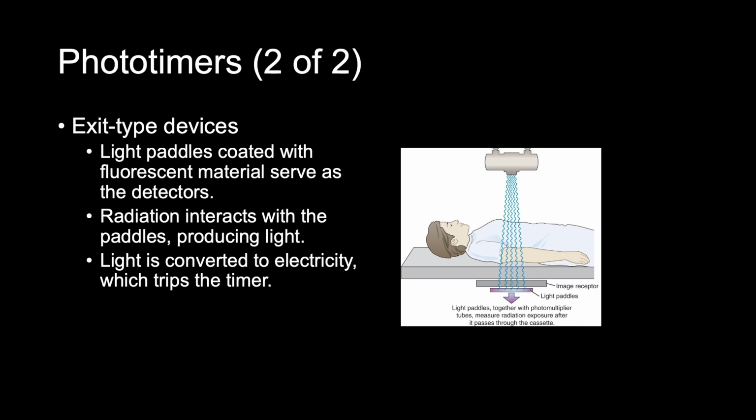The phototimers have largely been replaced with ionization chamber systems. So the phototimers had these paddles and were used back in the day. But that's ancient history now. Now we use the ionization chambers.